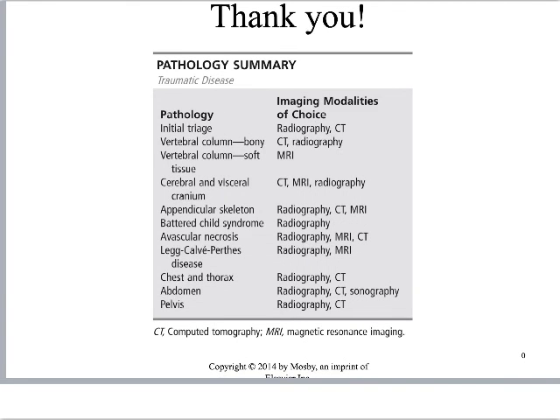So this is just helpful in terms of seeing where we fit in all of this. Understanding that in terms of that initial triage, we are often there in the room while they're doing that initial triage, doing a chest x-ray, cross-table lateral C-spine, or maybe an extremity exam like an ankle imaging or something like that. If it's any question of something that's happened to the head or to the spine, we're probably talking about CT or MRI. Probably CT first and maybe MRI if we didn't catch it on the CT.